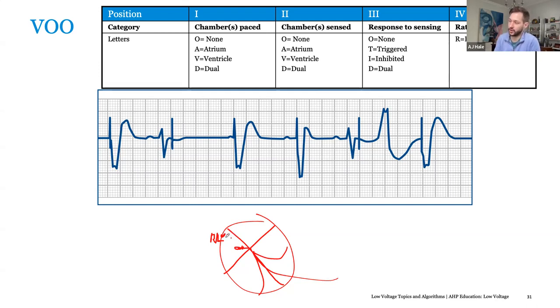So you have your atrial activity occurs, it conducts to the AV node, it hits a slight delay, and then it moves its way down the normal conduction system to depolarize the ventricles, right? Well, in this case, we are pacing at the exact same time in the RV. So you have this intrinsic conduction causing depolarization and this pacing that fuses at the same time. So anytime you see anything like this right here, this is a fusion because you're having the intrinsic activity complement our pacing activity. You may hear a term called pseudo-fusion. That just looks like we might have fused, but the complex will look exactly the same.